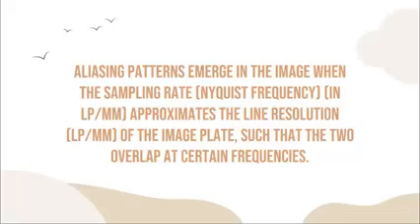Okay, so it happens kung sa film screen pa siya, nag-overlap ang duha ka grid with the same sampling frequency. Pero kung dire, sa inyong CR, nag-overlap both ang inyong CR reader and ang inyong imaging plate sa ilang frequencies.